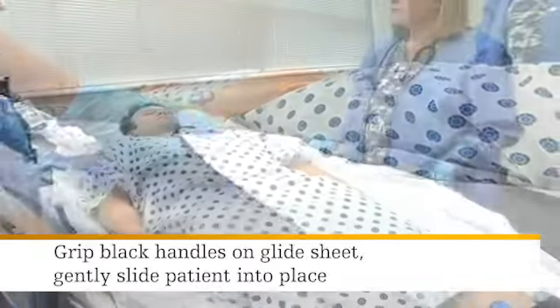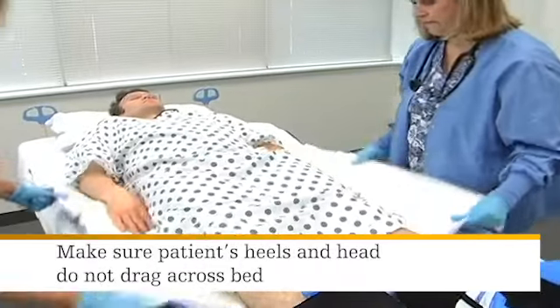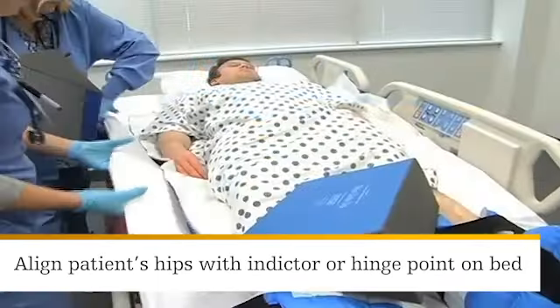Grip the black handles located on the side of the glide sheet and gently slide the patient into place. Make sure the patient's heels and head do not drag across the bed. Align the patient's hips with the hip placement indicator or hinge point on the bed.